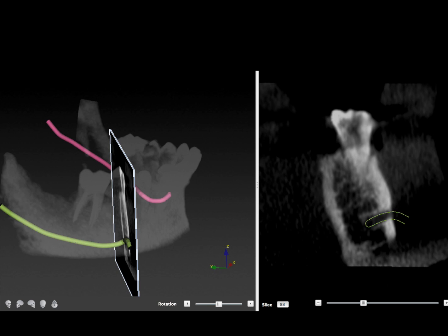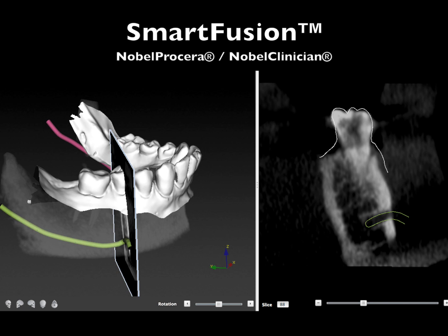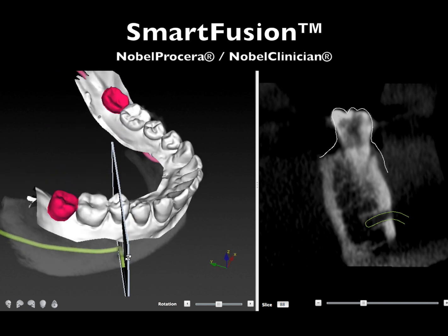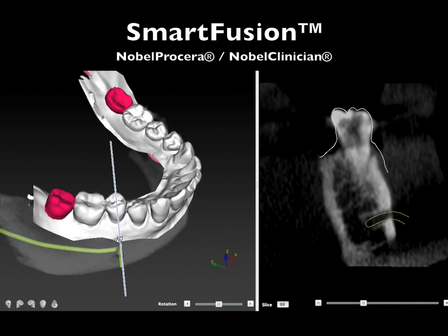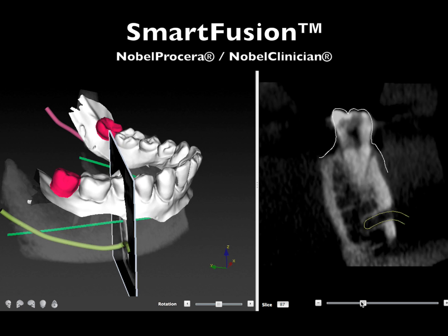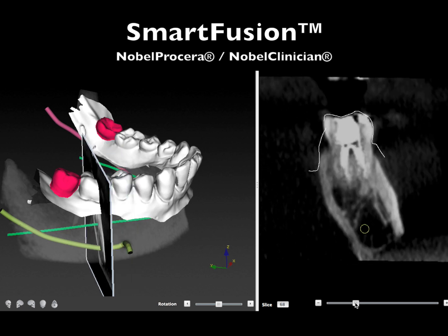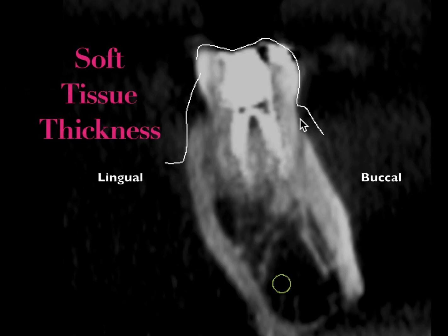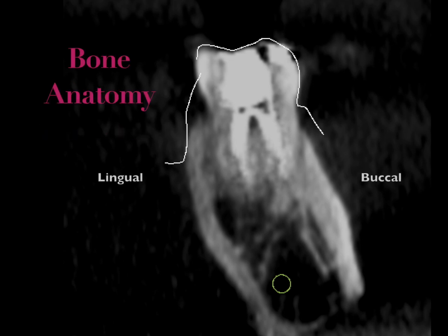During this presentation we're going to use Smart Fusion technology to have a look at things. Smart Fusion technology is a blend of a model that's scanned into the computer into the Nobel Procerer software, and also a wax-up which you can see in red here — they're fused into a CT. When we put all this together we can actually see the soft tissue thickness: the white line down to the bone on both sides shows that the lingual is actually quite a bit thicker than the buccal aspect.